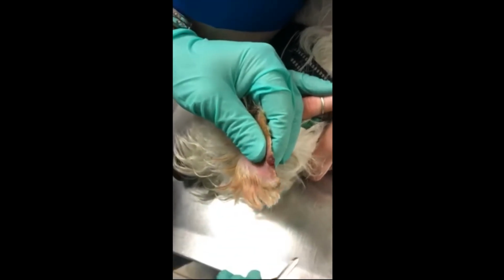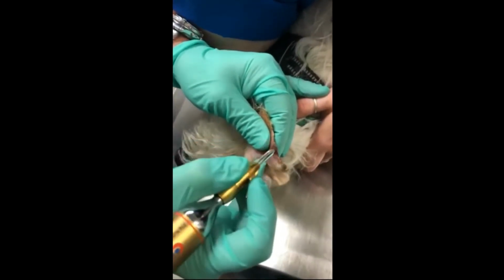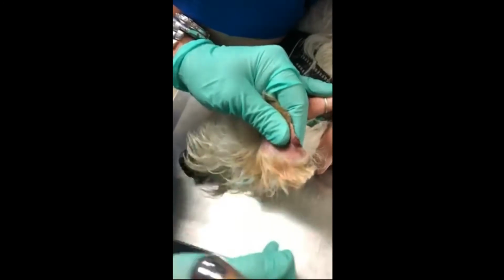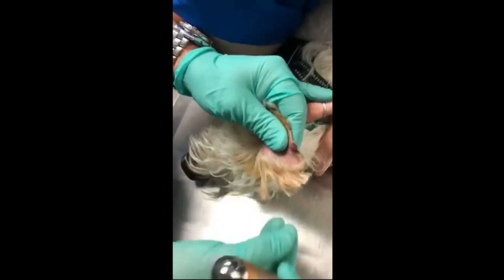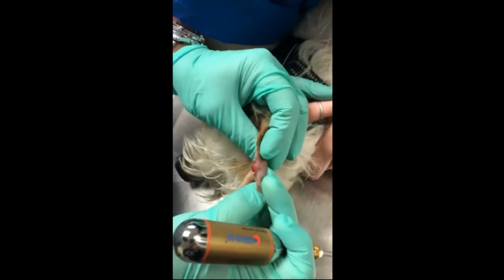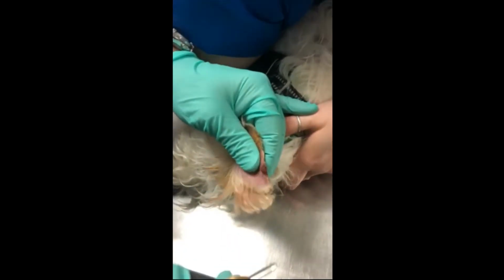We're going to do a 40 to 45 second freeze, followed by a thaw cycle, followed by a second freeze cycle. And then we will give it approximately 2 to 3 weeks to fully go through a cycle. If at that point in time there's any remaining tissue, as there is some depth to this mass, we'll go ahead and just touch it up at that point in time.